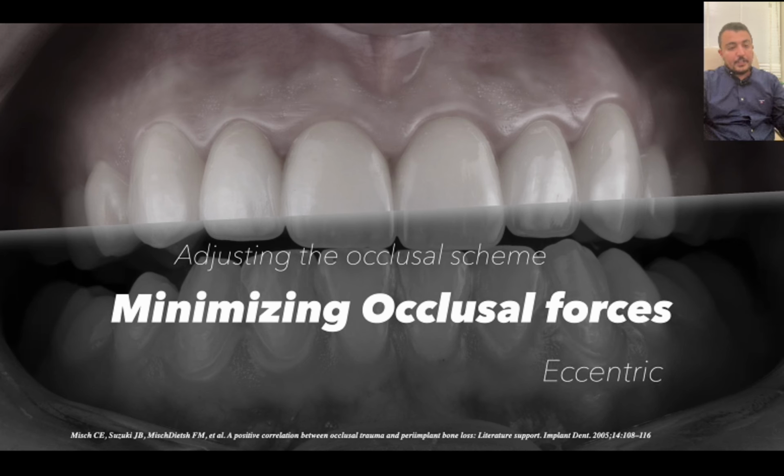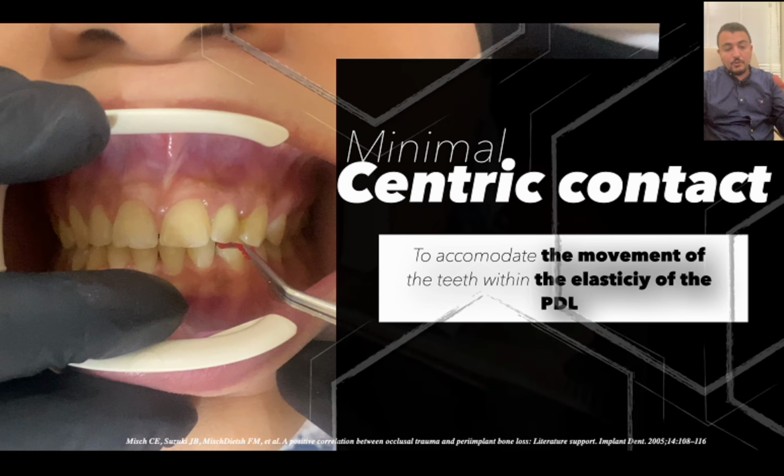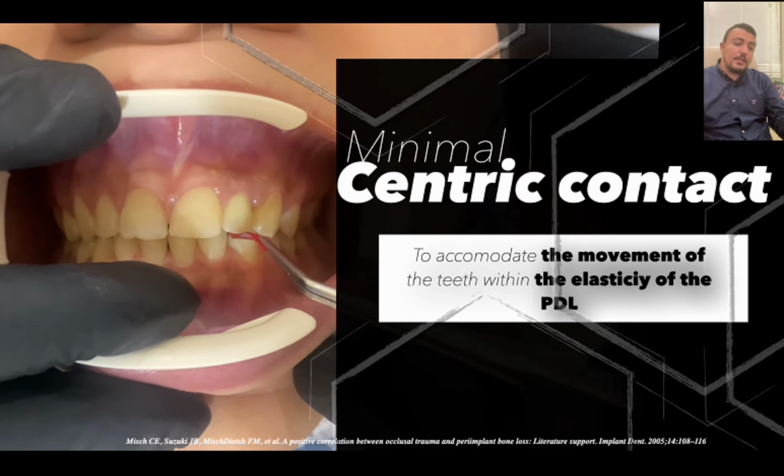So a very nice criterion for the occlusal analysis is to record and to analyze that we have a minimal centric contact to accommodate the movement of the teeth within the elasticity of the PDL without placing heavy forces on the implant crowns.